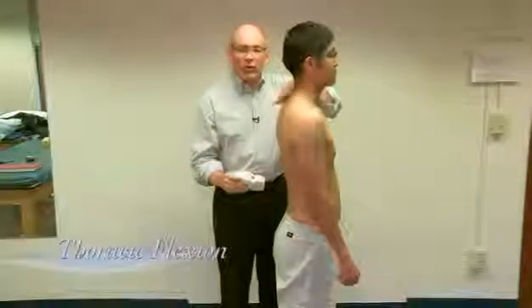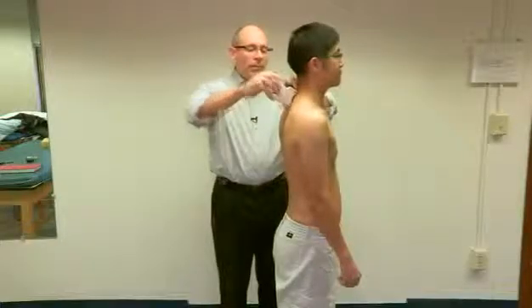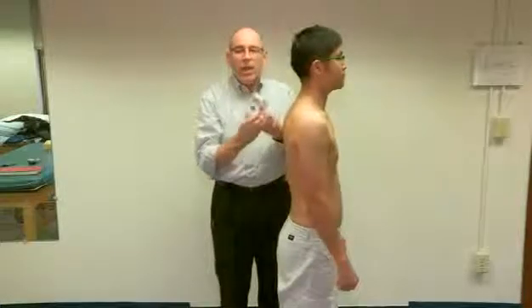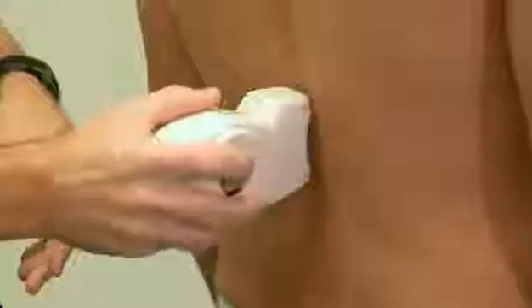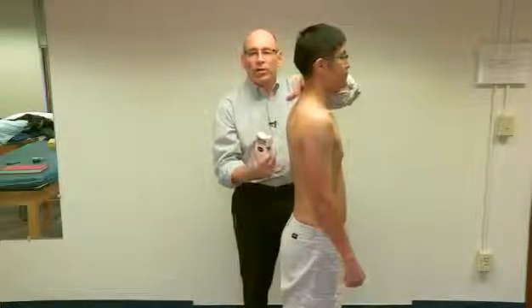Now we're going to look at thoracic flexion in the sagittal plane. With the subject's head dropped forward, C7 is located and I place the inclinometer right there. I set it, ask him to reach down as far as he can, mark it, and come back up. He had 117 degrees of flexion total. To isolate the thoracic contribution, I reposition at the lumbar level and get 107 degrees. We subtract that from 117 to find what can be attributed to his thoracic spine.